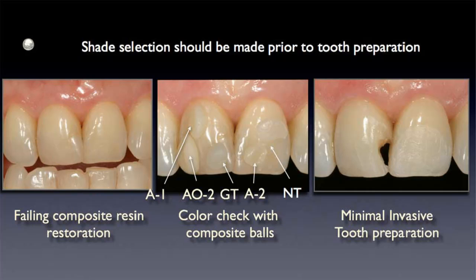Then from there, one of the things that I do is I place a clear strip interproximally, so that I can be sure that I don't have any sort of etchant or adhesive in between here, because I do what's called a freehand sculpt or freehand build technique.